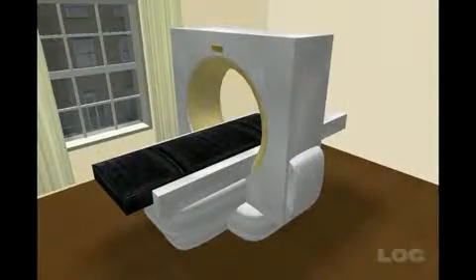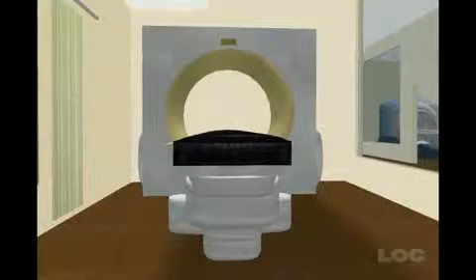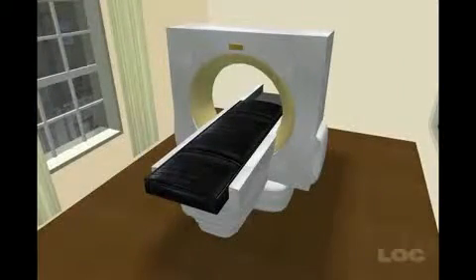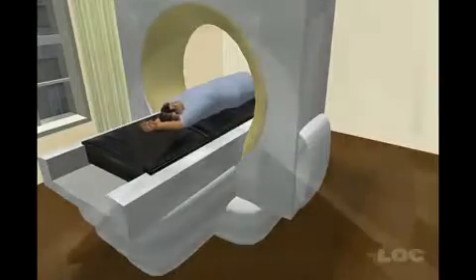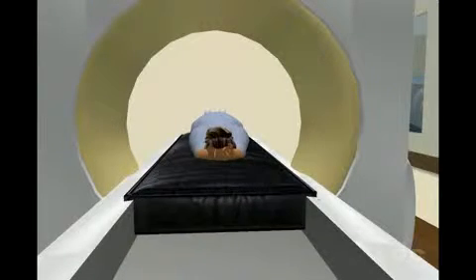Another frequently used scan is a CT scan. CT stands for computerized tomography, a device which takes many X-rays from different angles and uses a computer to create a 3-dimensional picture of the inside of the body. The CT scanner consists of a moving couch, not particularly narrow, that slowly moves a person through a hoop that has the shape of a very large donut. The vast majority of people will not experience any sense of claustrophobia.